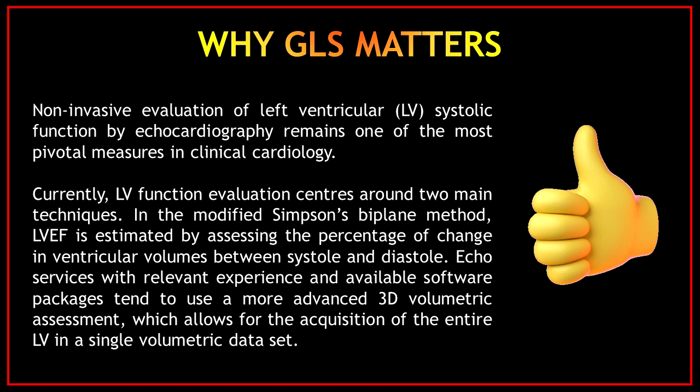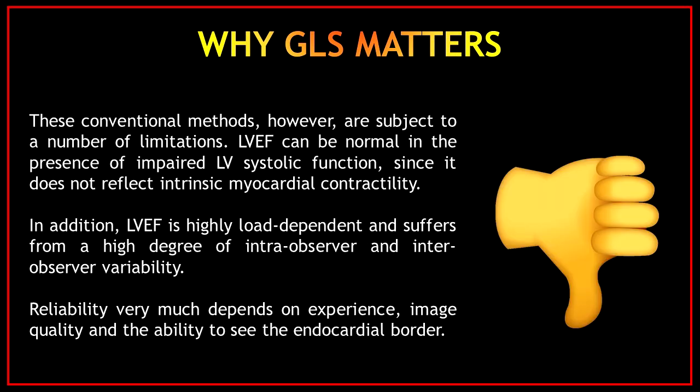And echo services with relevant experience and available software packages tend to use a more advanced 3D volumetric assessment, which allows for the acquisition of the entire left ventricle in a single volumetric data set. These conventional methods, however, are subject to a number of limitations.